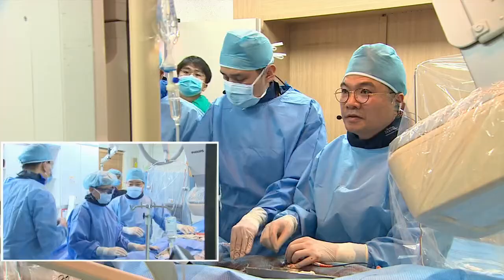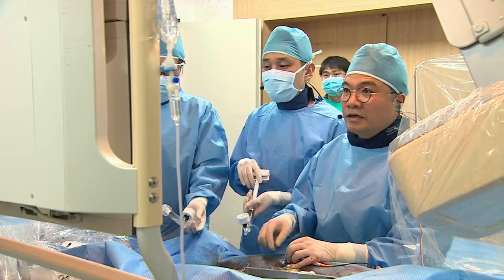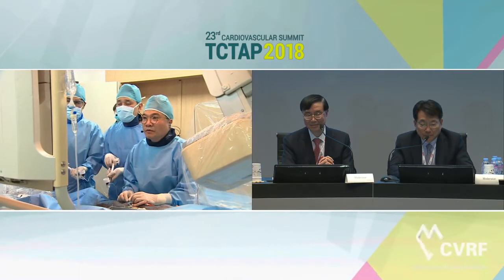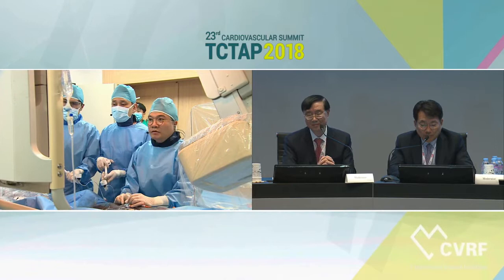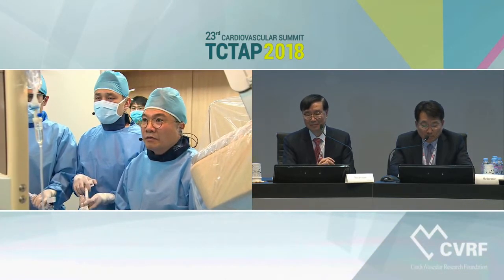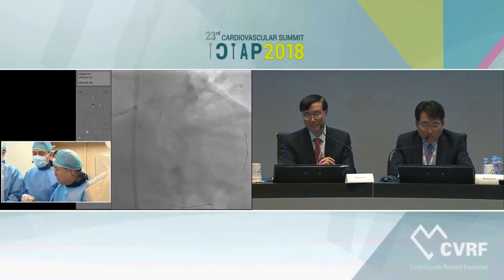Dr. An, let's start. Yes. So right away, the left main proximal is done with a 4.5 NC balloon, high pressure inflation, and then we're rewiring. And right now I'd like to do some kissing balloon. Great.